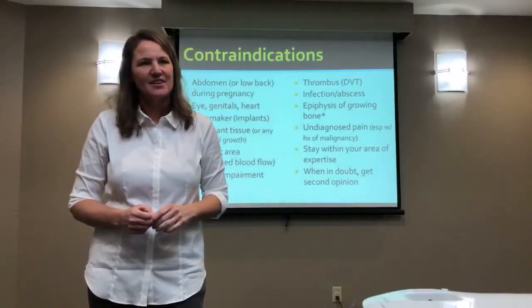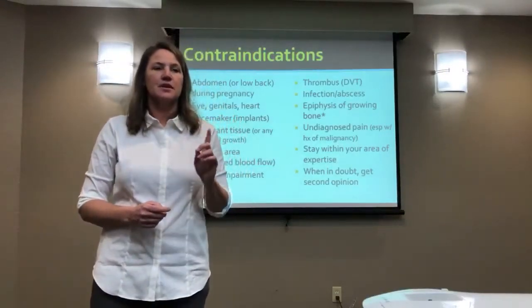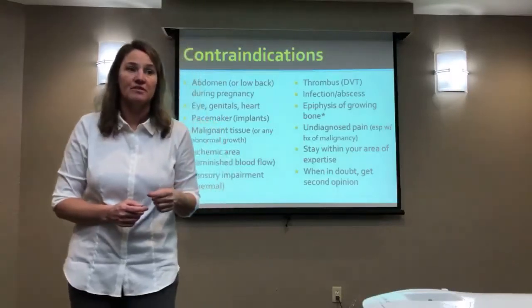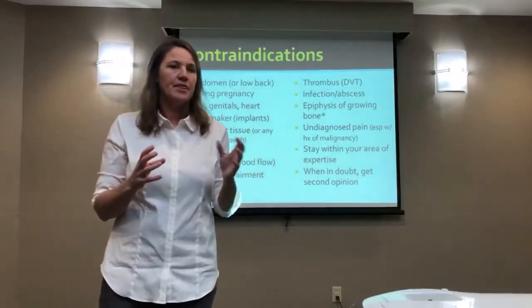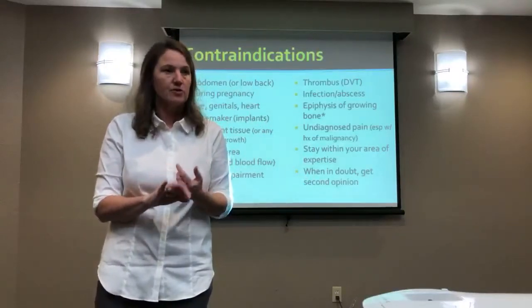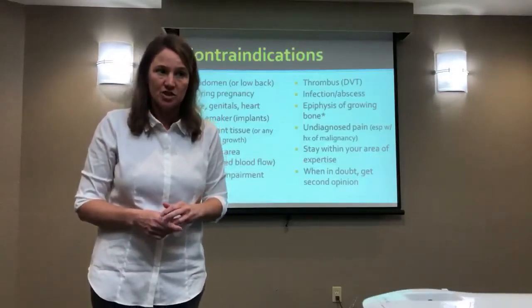But on the other hand, we do constantly look at this ultrasound question of the non-thermal effects. The one area where I think the evidence is being looked at the most is with low frequency ultrasound, simply because in the wound care realm there are companies out there that are financially motivated to do the research. Is it directly comparable? They're using what they call long wave or low frequency ultrasound, in the range of 20 to 25 kilohertz. That's the growing area where they're using ultrasound at a level that's not thermal, and they're using it in a way that is showing definite cell activity and tissue growth. If you want to compare, it is sort of apples and oranges because of the frequency.